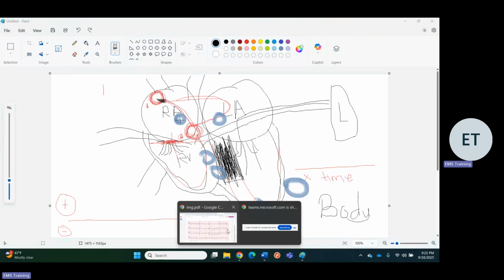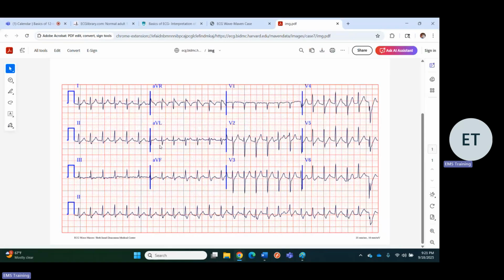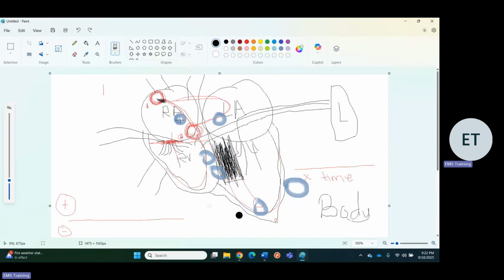So perhaps we have some degree of a paroxysmal SVT, or this could even be a 2-to-1 A flutter, and the flutter wave is buried by the preceding T wave, alternating with an AVNRT. So the P wave is after, which to me would indicate that there's this like circular thing going on right at the AV node.